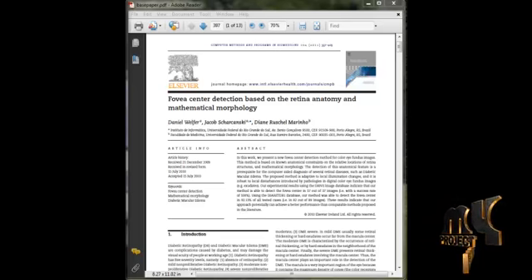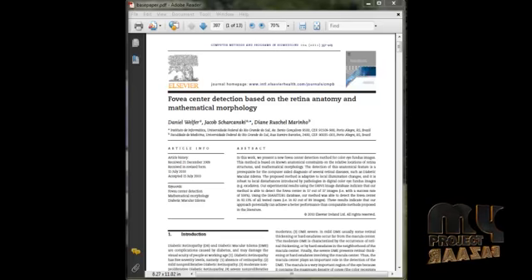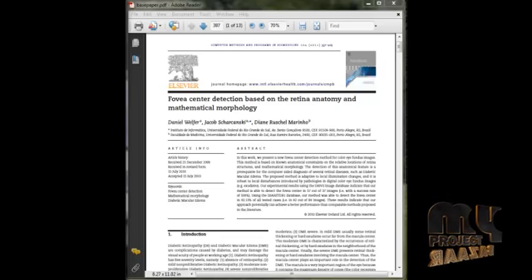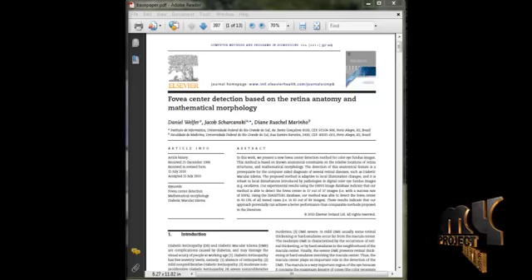Using DRIVE image, the result of the detection of fovea center in 37 out of 37 images acts as 100%. Using DIARETDB1 database, the result will be 82 out of 89. The result shows better performance compared to the previous method.